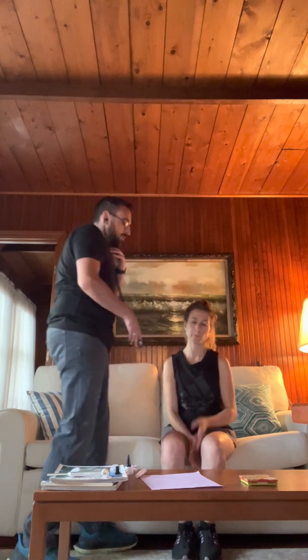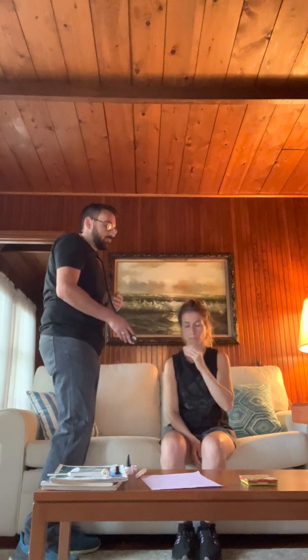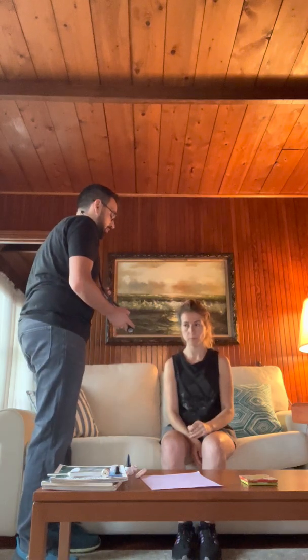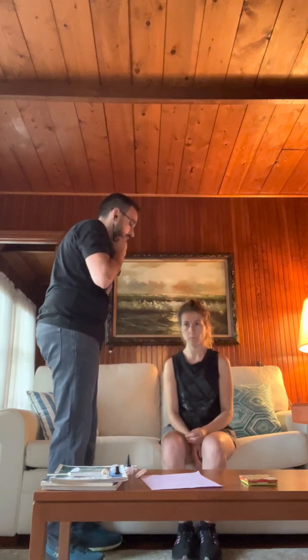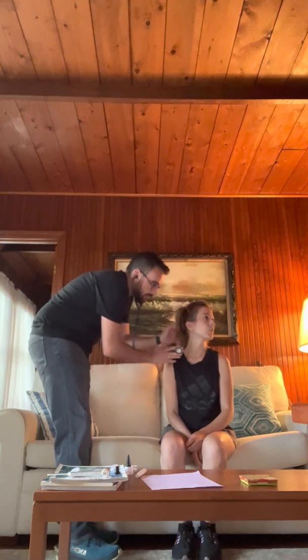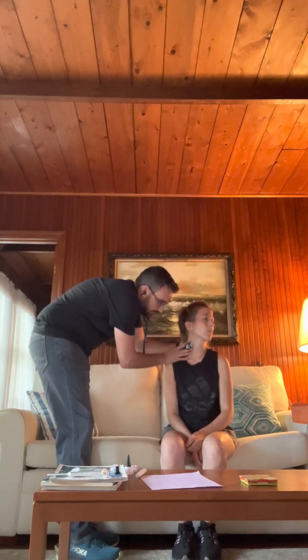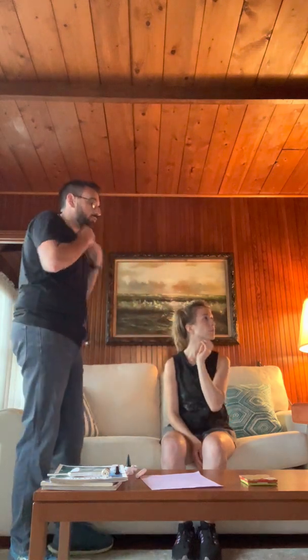Perfect. Now I'm going to auscultate her carotid pulse that I palpated earlier. Right here. If you can turn the other way, and your jugular venous pressure. Perfect. We're checking for bruit.